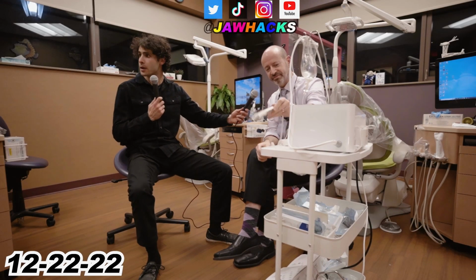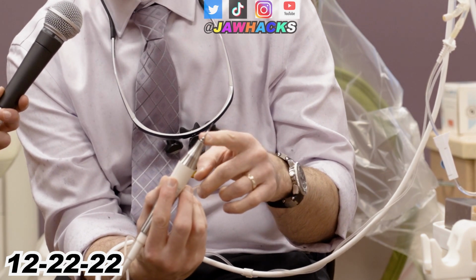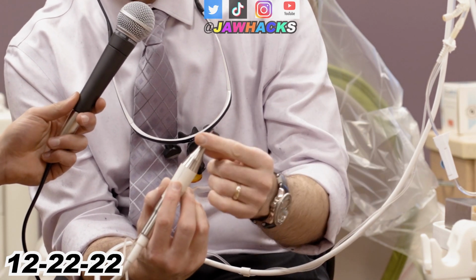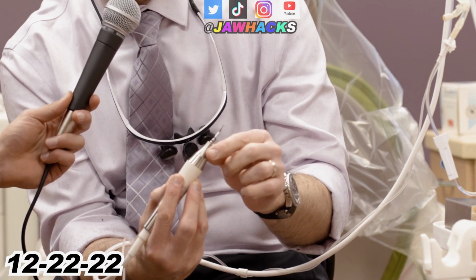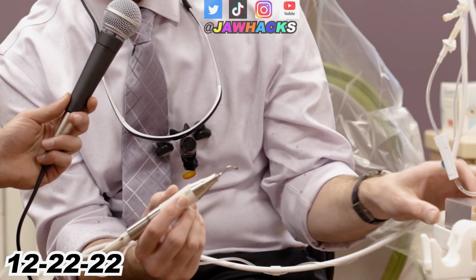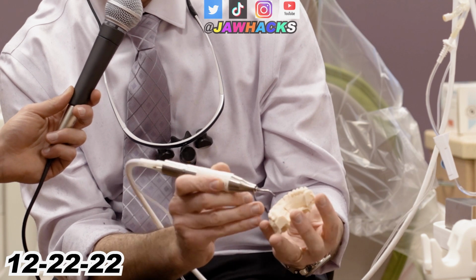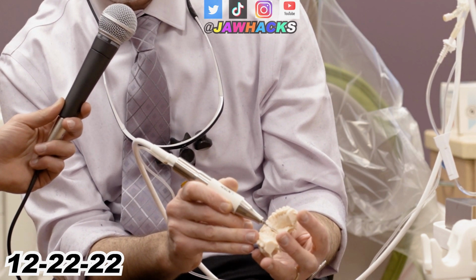Show us what's going on here. So that's a PIEZO knife. It has different tips. This one is a square. There's one rounder. It's actually got a jagged tip that looks almost like a saw blade. That tip vibrates, and then when the patient is numb, you just go right in through the middle. Like that, gradually, obviously not that fast.